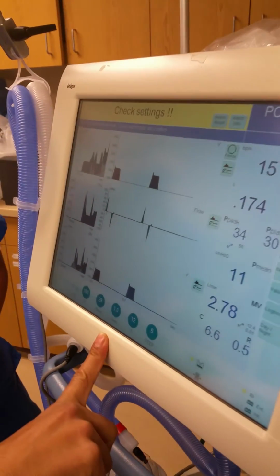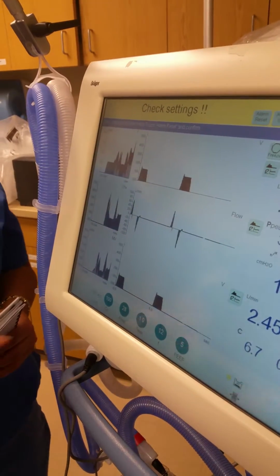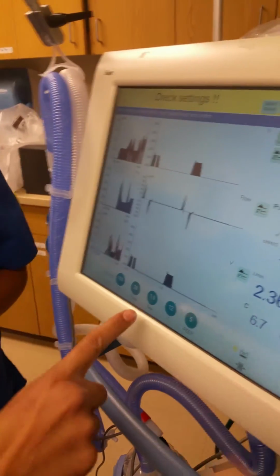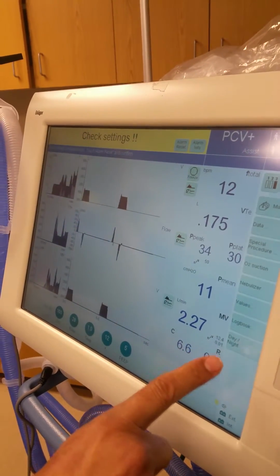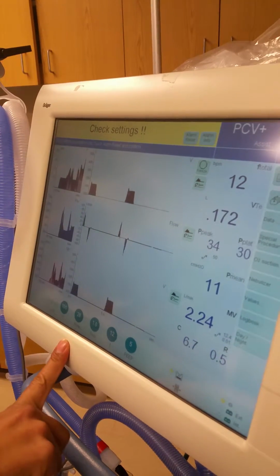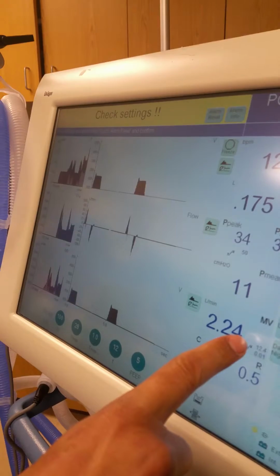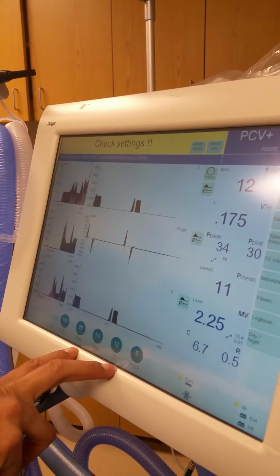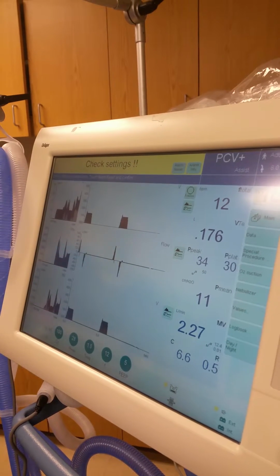Oxygenation: inspiratory time affects oxygenation, and oxygen affects oxygenation. And then frequency is your rate, which is going to affect your minute ventilation, which will affect blowing off your CO2, right? And then inspiratory pressure is going to affect your tidal volume, which can also affect your minute ventilation. So you could do a combo of these two to increase or decrease minute ventilation, depending on what direction you need to go with your ABG.